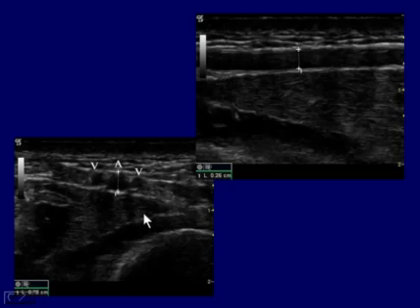This slide here is showing that we can measure diameter well in either sagittal or transverse. Transverse is the textbook way to do it. And in this example, our variation, one measure to the other, this is 2.8 millimeters, this is 2.6 millimeters. Not very different, certainly not going to be clinically significant. However, if you're looking at things transversely, you know that you're not oblique to the vessel and perhaps have slid off a little bit, and your measurements will thus be off in a sagittal approach if you're not careful.